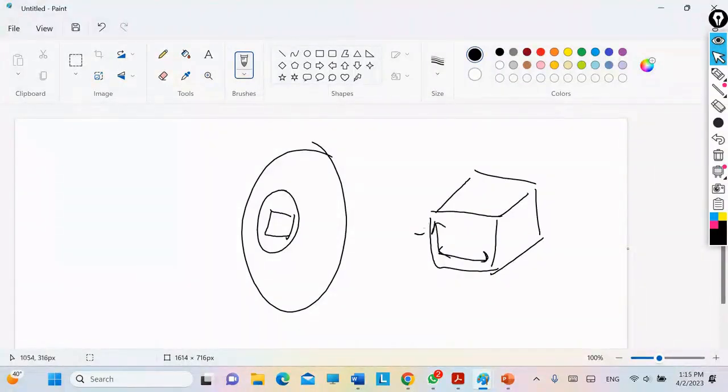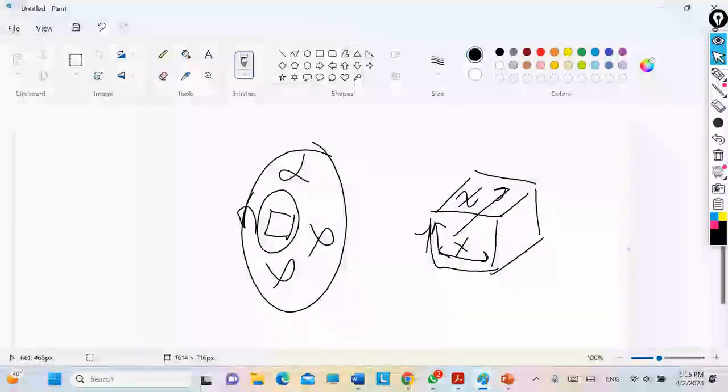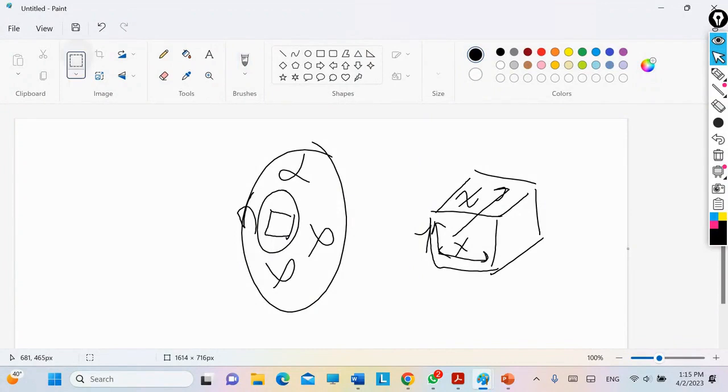All right, what do I want to do? I want to tell the machine, I want you to extract the signal from this square. At the same time, I want to say, cancel the signals from the other tissues. I don't need them. I only want this voxel. Is that correct? Because if I take the signal from the entire brain, there will be interference. I only want to focus on this voxel. How can I make my device understand that it should only excite this voxel and receive the signal only from this voxel? This is the trick. How do I do this?